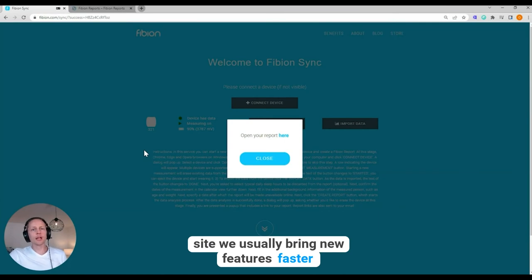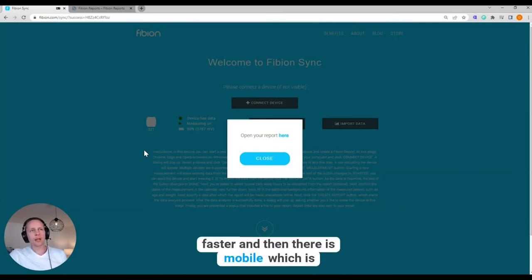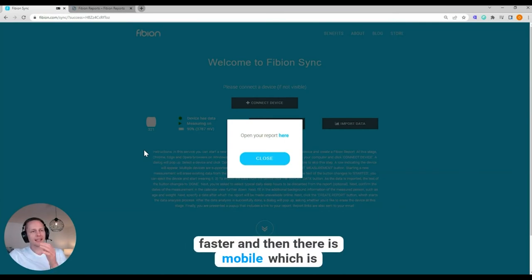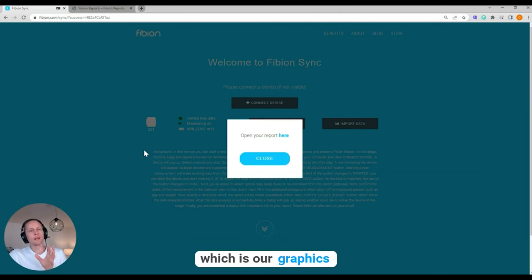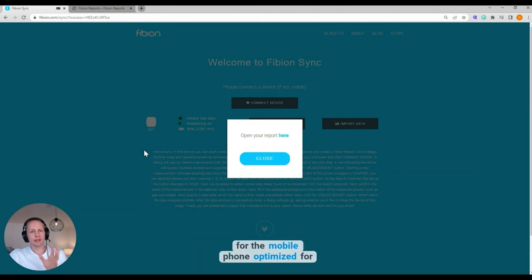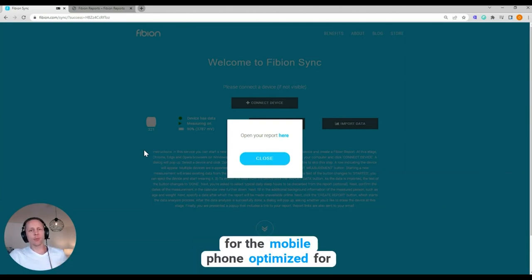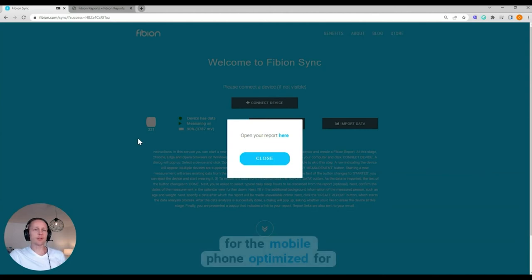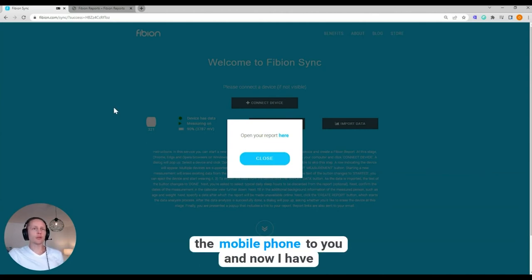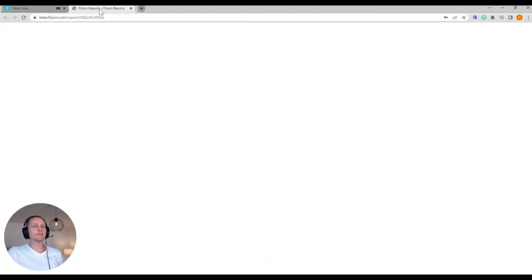We usually bring new features faster. And then there is mobile, which is our graphics for the mobile phone optimized for the mobile phone view.